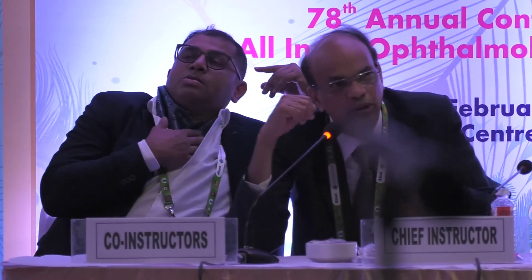Now there is an emphasis on good screening in the large population, and for that, for tonometry, you can carry the pneumotonometer along with you, and it does a good mass screening. For angle closure glaucoma, you can do a good flashlight test, and obviously, like you do diabetic retinopathy screening, you can do the optic nerve head evaluation. So this makes sense. And if you suspect anyone has glaucoma, then you can bring them to the base hospital, do a thorough investigation and treat them accordingly.